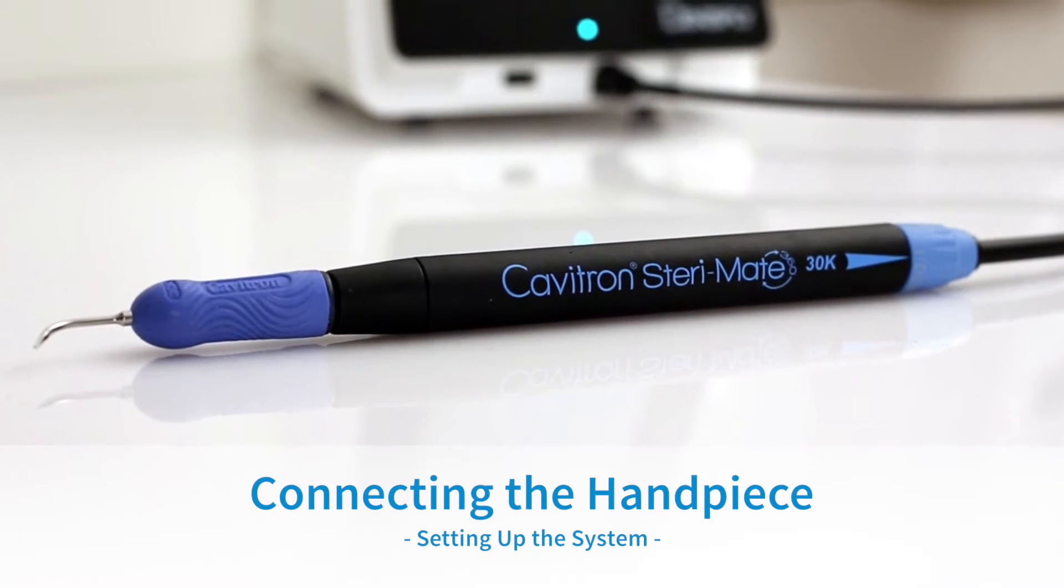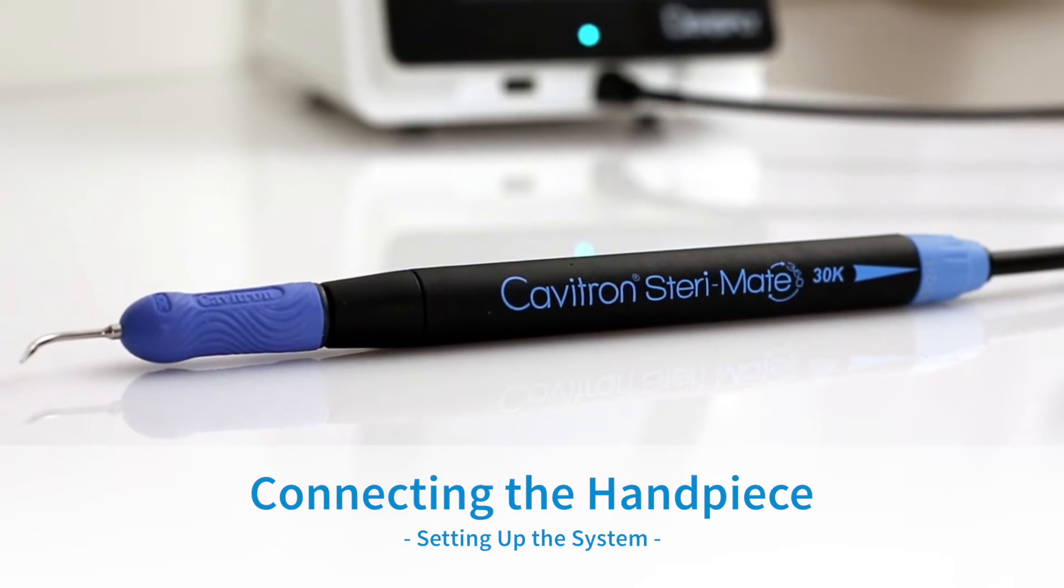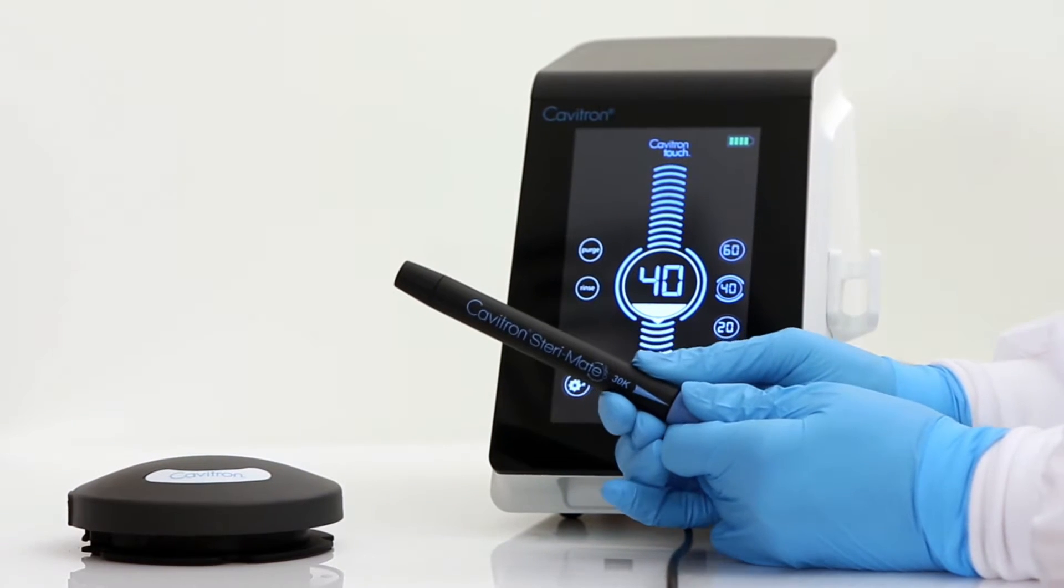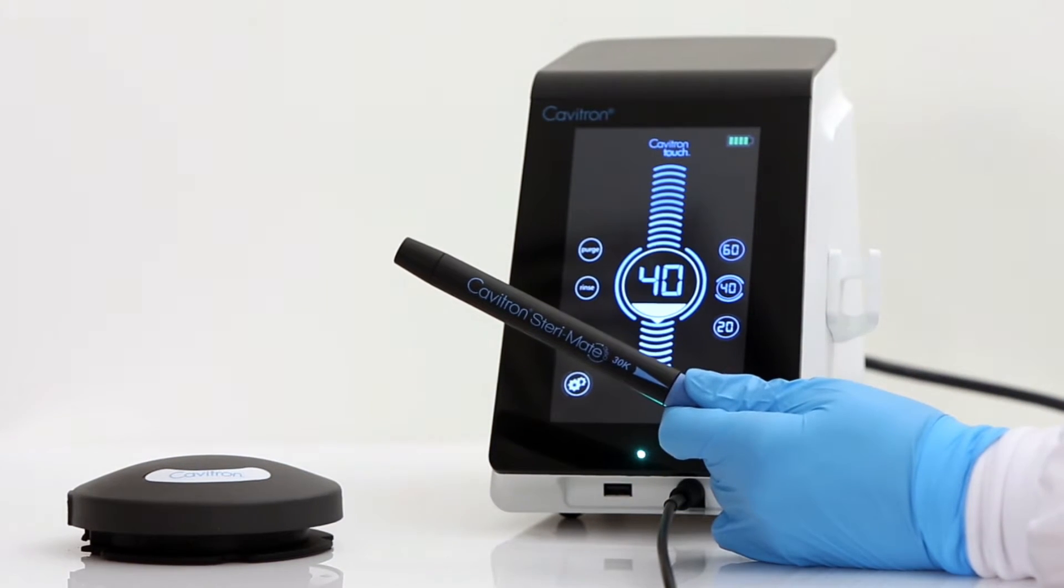Connecting SteriMate 360 handpiece to the Featherweight Detachable Handpiece Cord. To connect the SteriMate 360 handpiece, please insert the handpiece into the connection on the Featherweight Detachable Handpiece Cord.